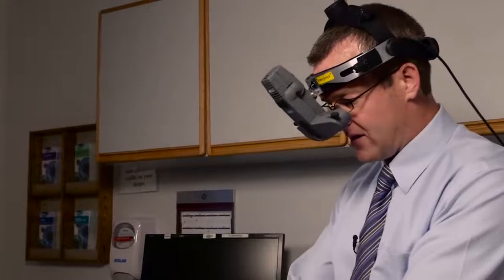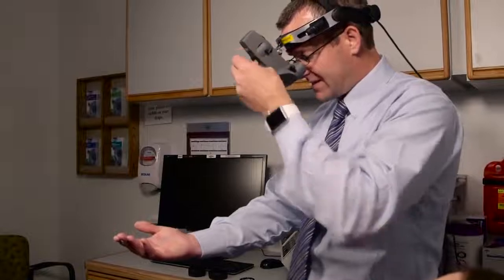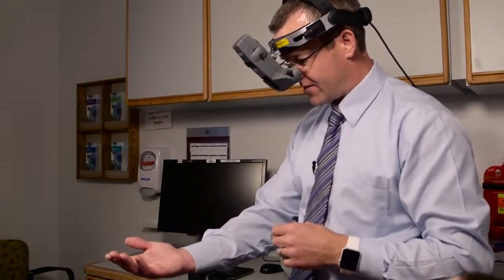I make sure that that's centered, because I know that'll help me to get my best possible view of the periphery of the patient's retina. Okay? So that's basically the nuts and bolts of getting the indirect ophthalmoscope ready.